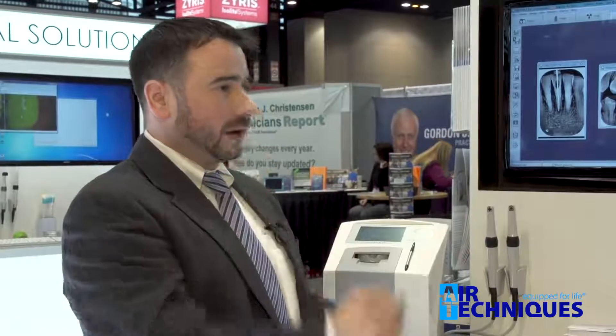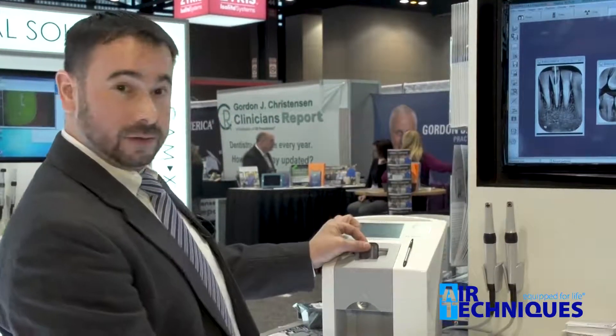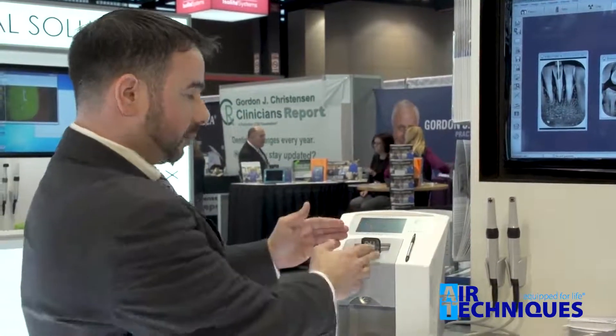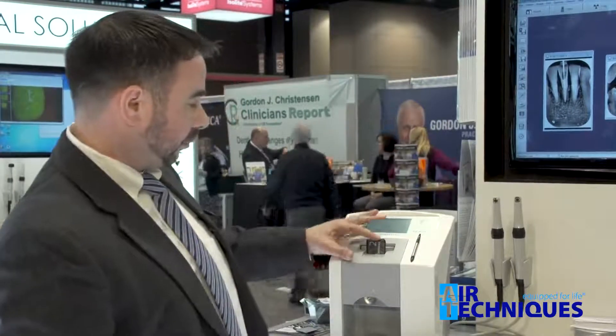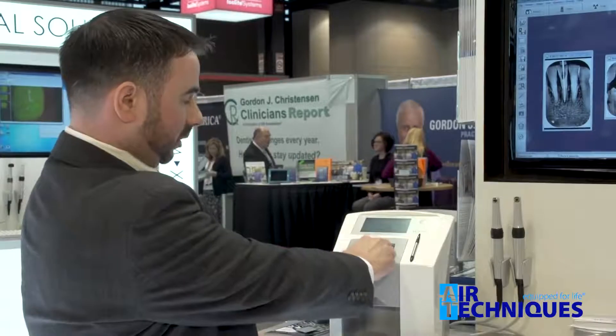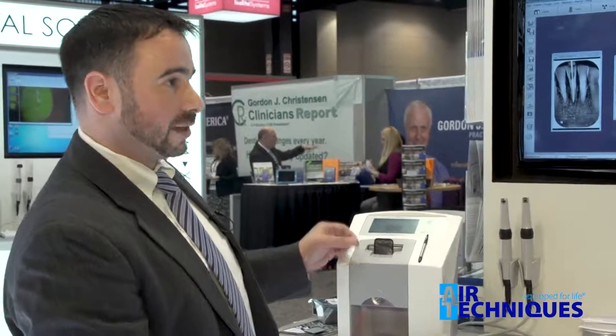Once we've taken our exposure out of the patient's mouth, we have an easy open notch that allows us to open the barrier envelope. I simply place it in here, and this mechanism grabs the plate and barrier together. By simply pushing the plate down, the plate travels through and the barrier envelope stays. And within seven seconds, we'll have an image on screen.